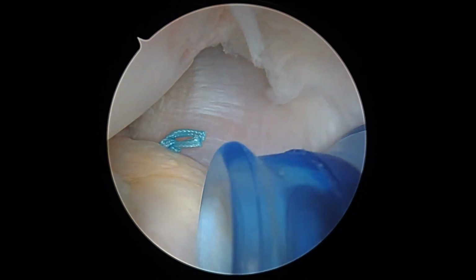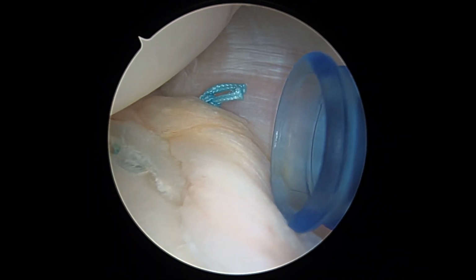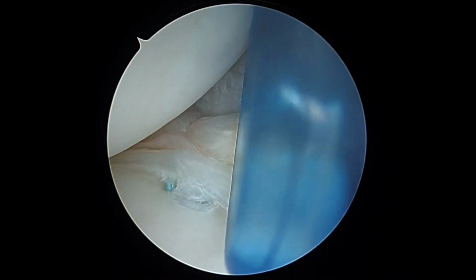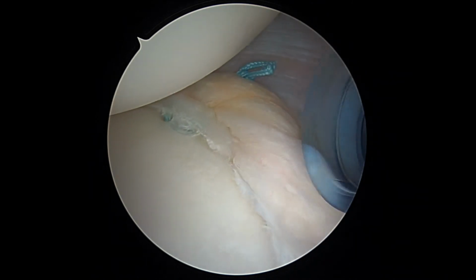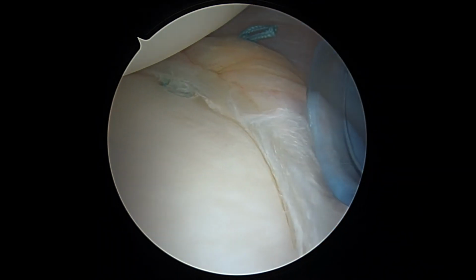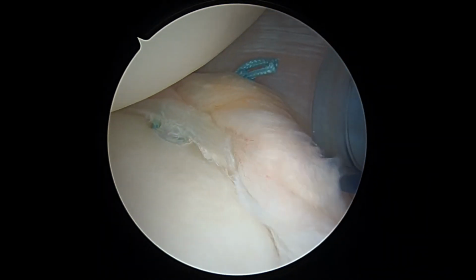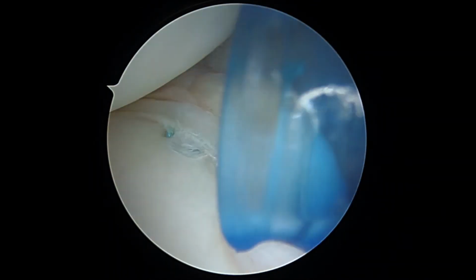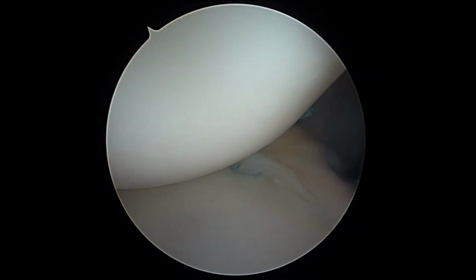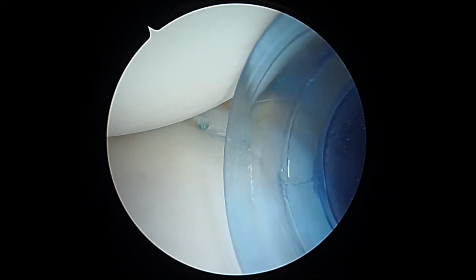Okay, here you can see how we've shortened up this posterior capsule and created an extra fold right behind the labrum. That should all heal together given a little bit of time. And remember, that's the back of your shoulder. The primary direction you are having instability is the front, but just like you have to hang a hammock on two trees to get it off the ground, we've got to put a tightening stitch here so that we can really tighten even more up here. In fact, just putting in that one stitch has already tightened up that band, but we're going to tighten it even further. So let me go off on the video for a second.